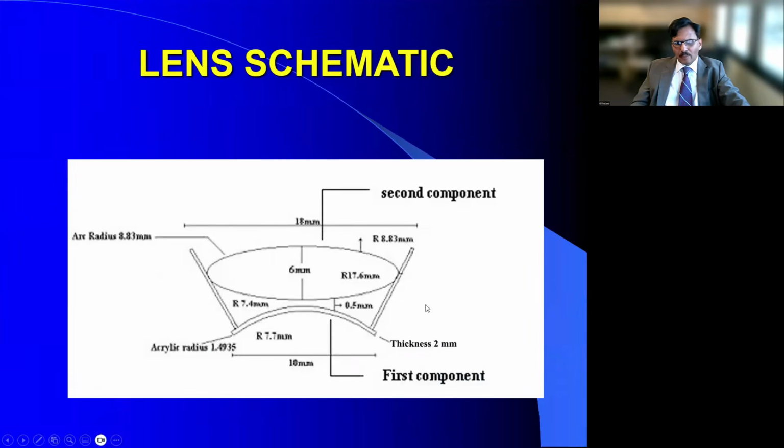So this is a little bit more detailed lens structure here that is usually used. You have a neutralizing corneal curvature. You use a viscoelastic of some kind, probably a Healon because of its clarity and the ability to stick. And then you have the radius of curvature, the size of your lens. And remember, the visual field is a function of the diameter.